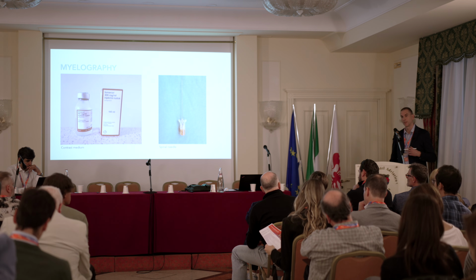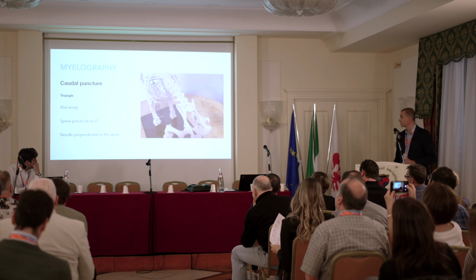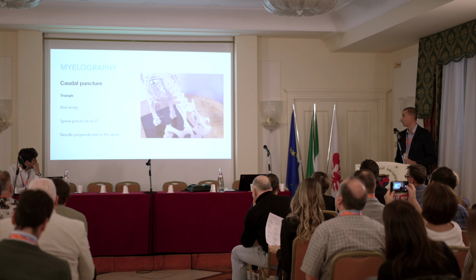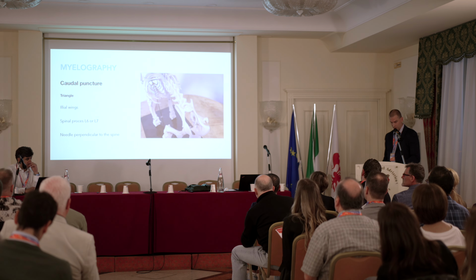So for caudal puncture, as for all punctures, I use some anatomical landmarks. Those anatomical landmarks here are the iliac wings here, and the tip of L7 here, and I apply my fingers on it, and then I will apply the needle. So let's see the video.